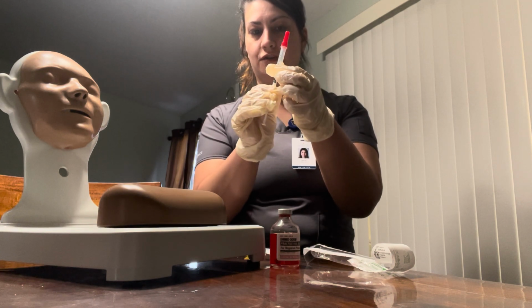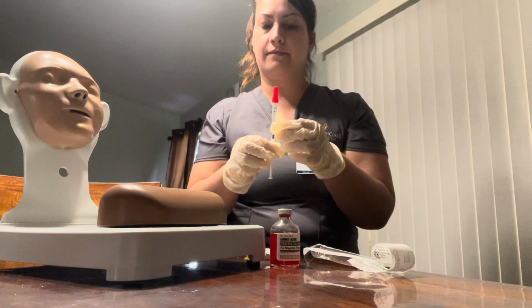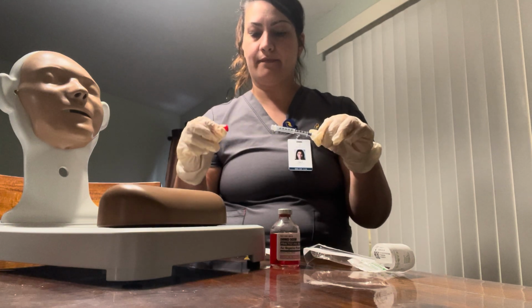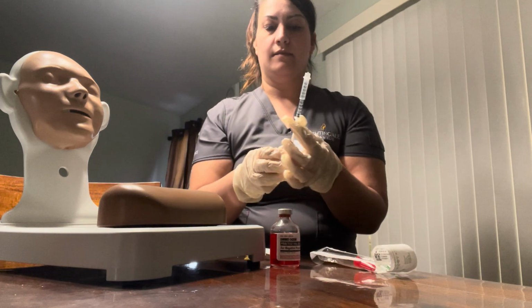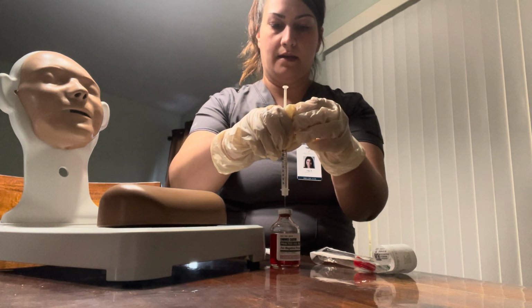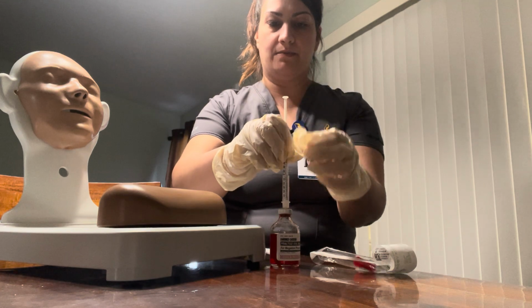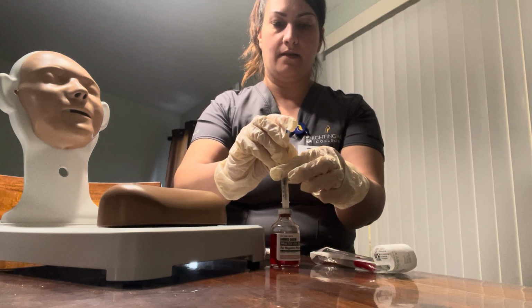Okay, and I will show you guys 1 milliliter of air. Next, I will remove the cap. Put it in the vial and make sure that I don't touch the medication. I will push the air into the vial.